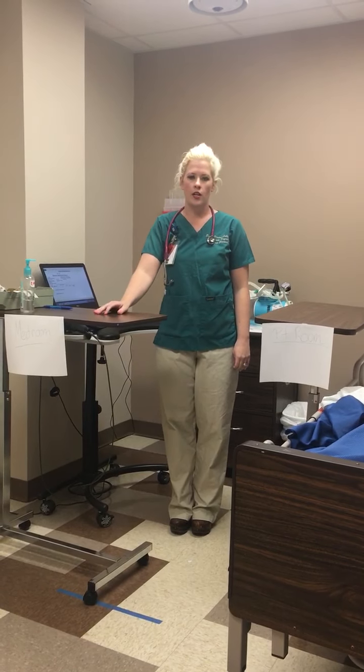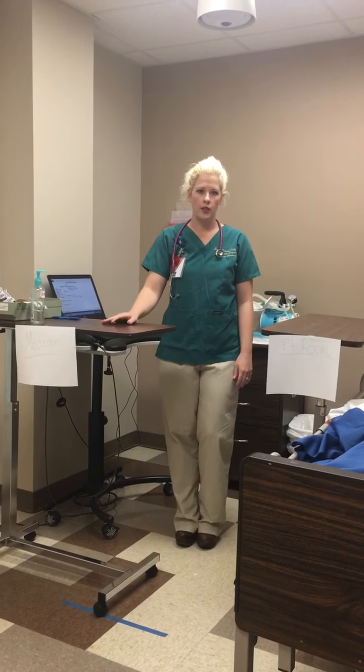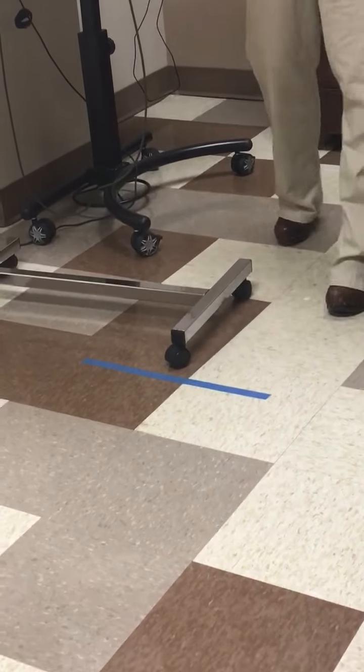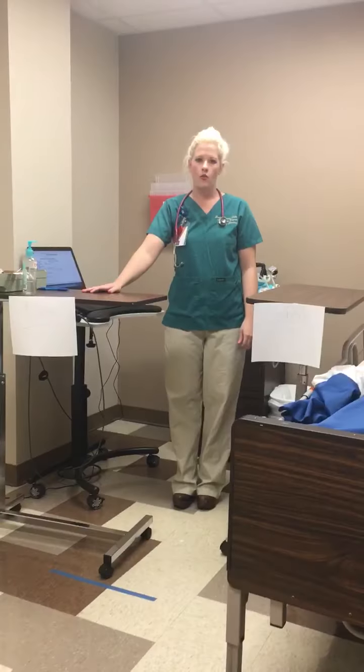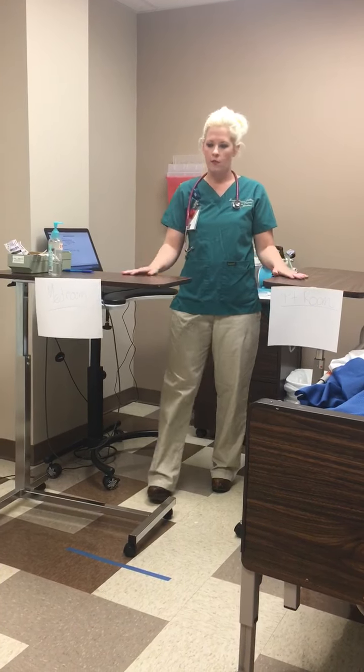So today we're going to be demonstrating IM and sub-Q injections. I'm just going to orient you to the room just a little bit. If you see on the floor of the lab, we have a blue piece of tape. We need you to stand behind that blue piece of tape when you are taping because that is where the camera is.